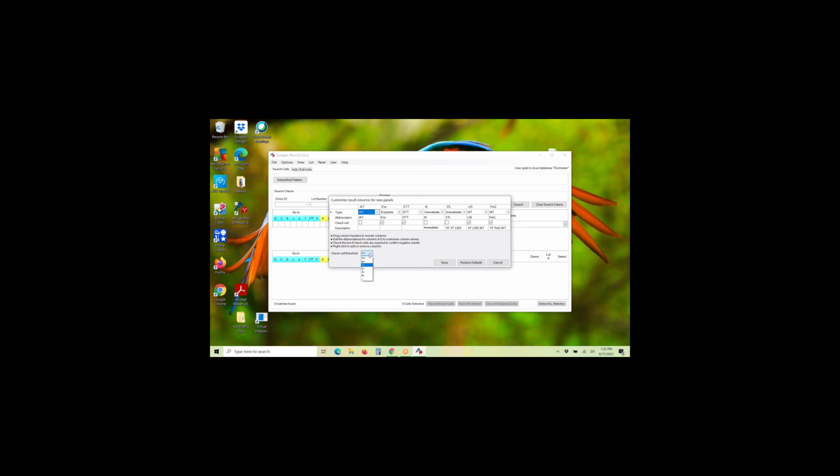And the last thing here is your check cell threshold. Everything's included here, but I wouldn't recommend anyone use anything less than a 1+. Those were just in the list. They're here, but I wouldn't select that as a threshold. But we did also add a check. I know some labs, the labs I've worked in, most of them have wanted to have just a check mark rather than a graded reaction.